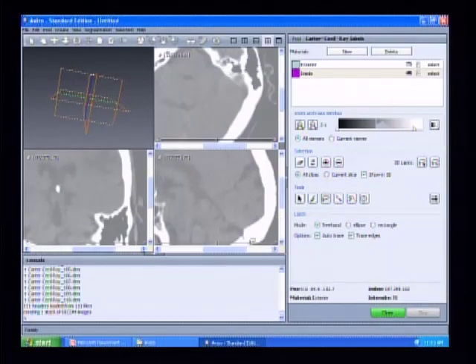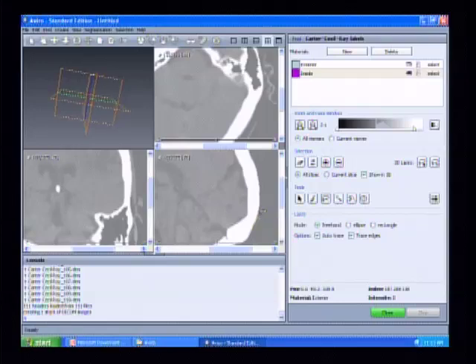You can click along an edge. Can you see this yellow line? You can see how it hugs the border of the white area, and it really won't go out into the darker space. So it's fairly accurate in being able to detect the edges.